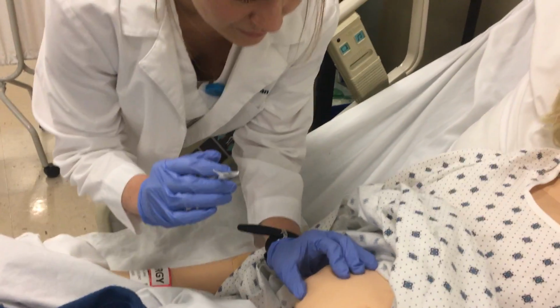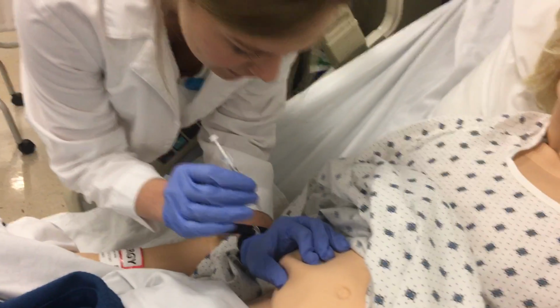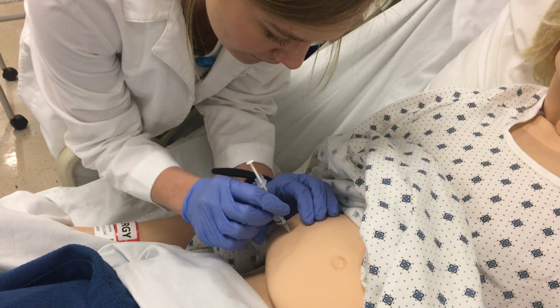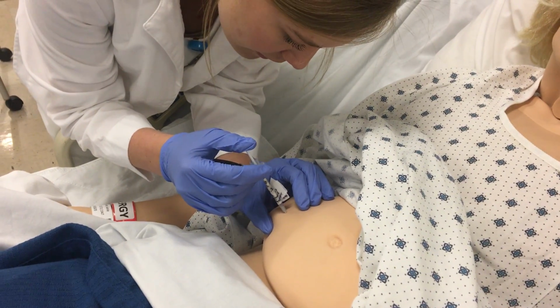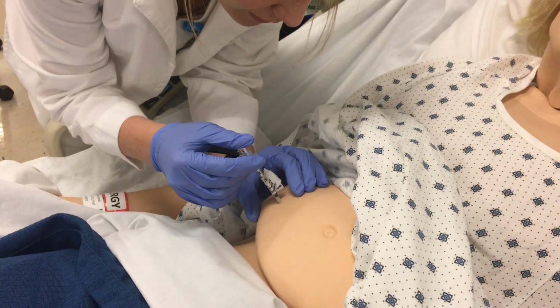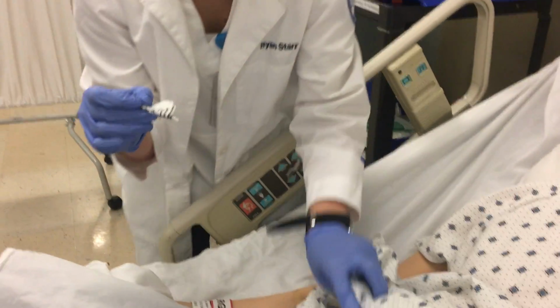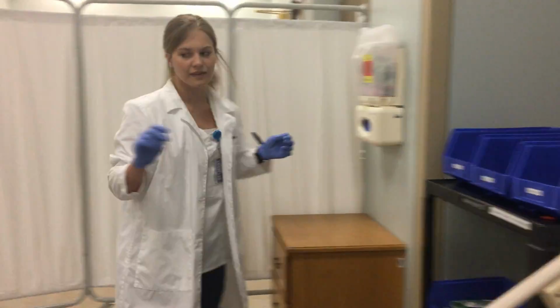So I'm going to come and start by pinching the skin, and I'm going to insert at a 90-degree angle. Slowly inject and hold for 10 seconds.